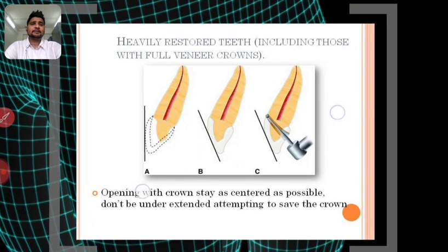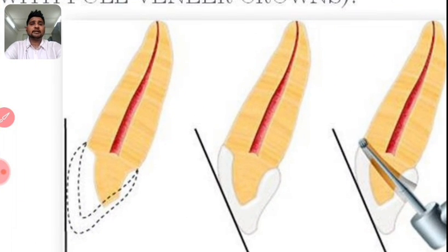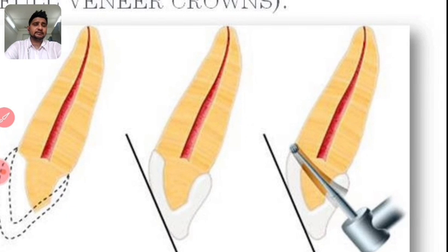And some tips about when teeth are crowned. See, you can see this angle of the stump is different, angle of the crown is different. You see this? Alright, and if you follow that and the canal is regressive, it's regressed because of calcification, you will end up with perforation. So take care of this. When teeth are crowned, be very careful.